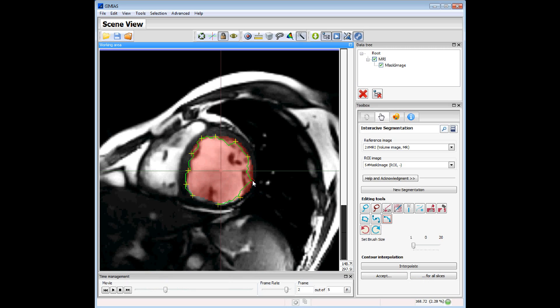We can also move the points, though this is slower because this method needs to compute the path. We can remove a point, switch to modifying points mode, and then add a point between two existing points.